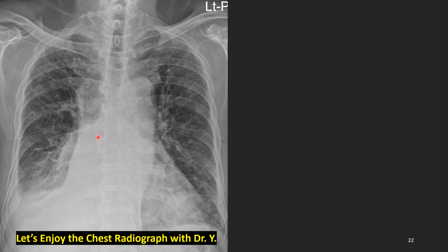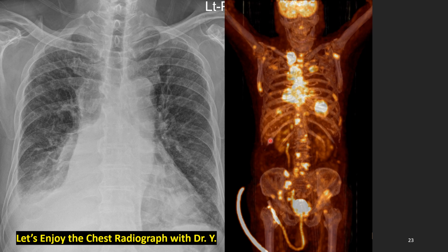What happened? Let's look at the PET CT. What do we find with these PET CT images? So incredible. The left lower lobe mass shows hot uptake. The right lower lobe mass shows hot uptake. Mediastinal lymph node, supraclavicular large lymph node, and so many bones are involved in metastasis. Spines are metastatic. Pelvic bone shows multifocal metastasis here. Left side bone shows metastasis here.